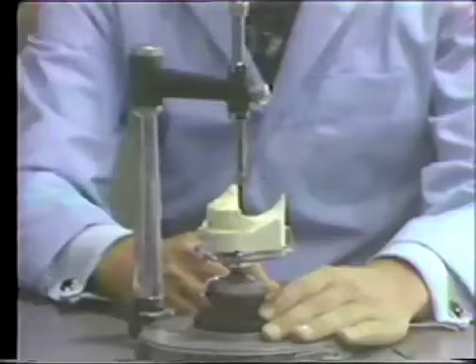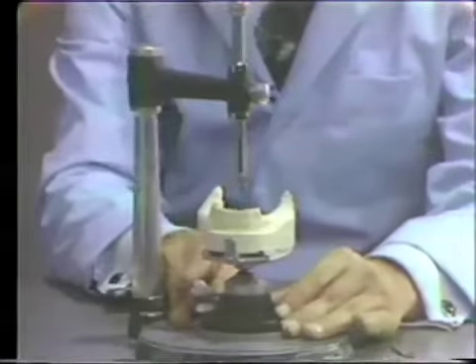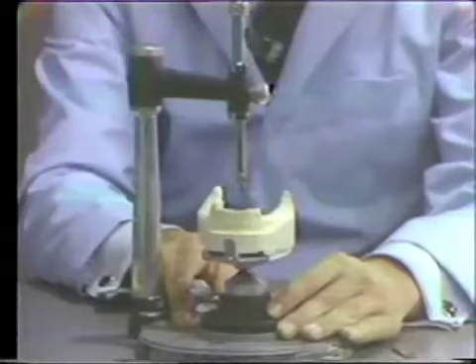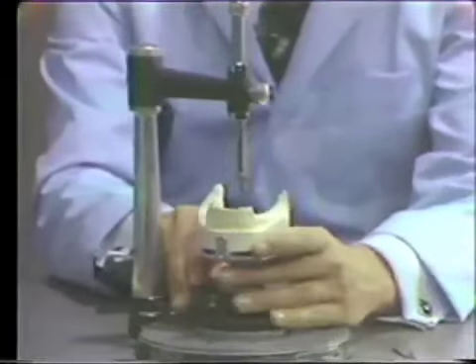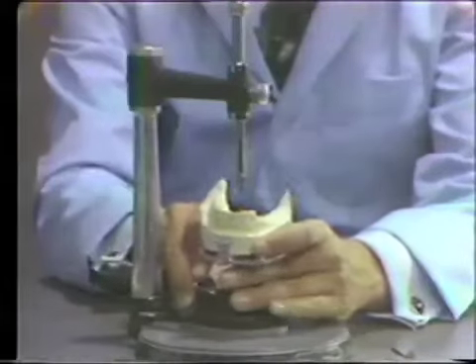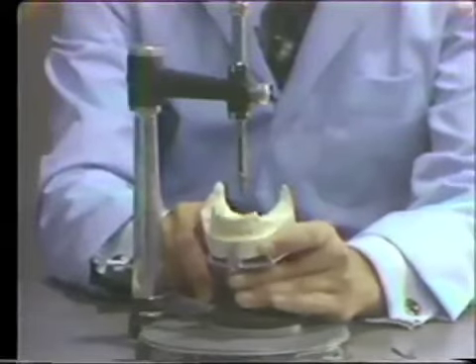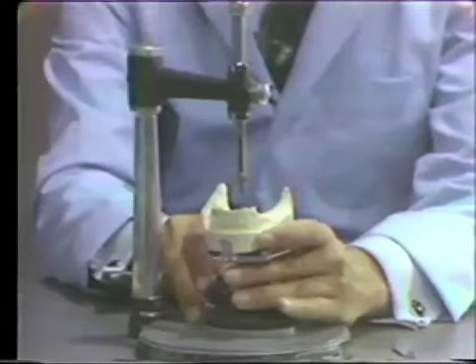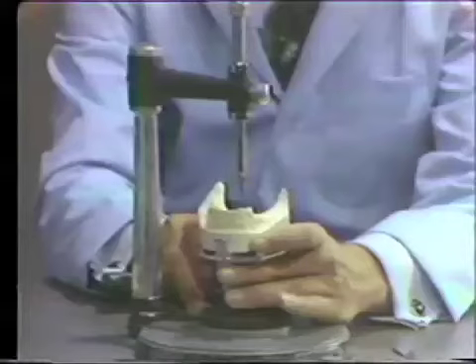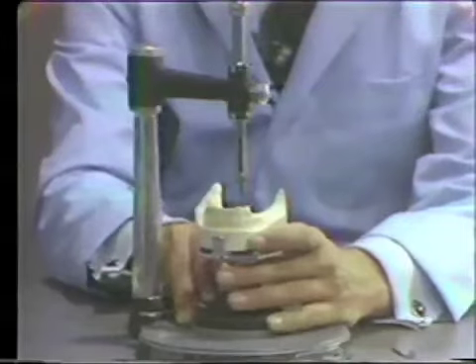Now, the best starting position for the cast is the most neutral position, which is horizontal to the tabletop or similar to the patient's mouth in the open position. It will allow you to get around over-contouring of teeth. If we tilt it one way or the other to any extreme, you'll find that you'll have to over-contour or under-contour crowns in order to get the partial denture into position. And so, since we are determining the path of insertion of the partial, the most neutral position is probably the best for starting.